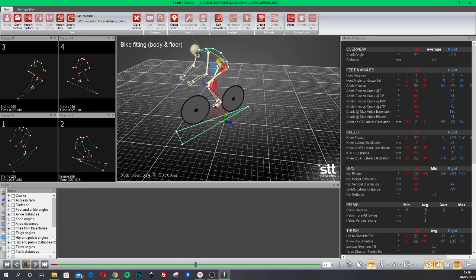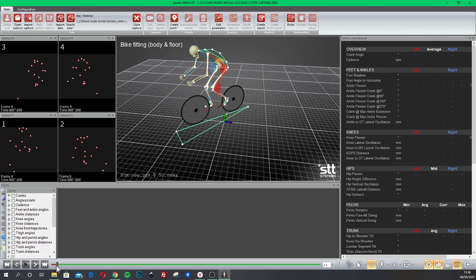Okay, it looks pretty fine. But what is true is that we have a small red part on the very beginning. Well, not only a red part, but a red part without information, and then kind of something strange here on the knee. Let me show you otherwise.